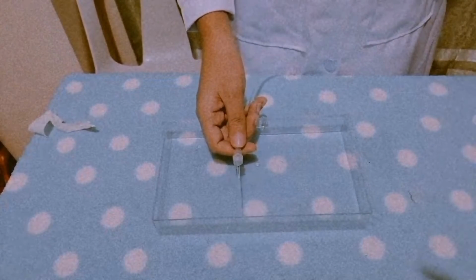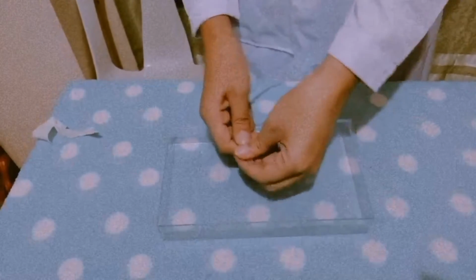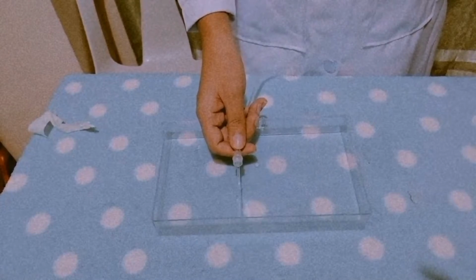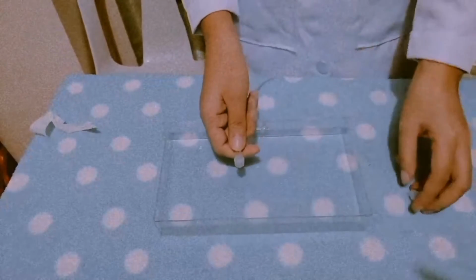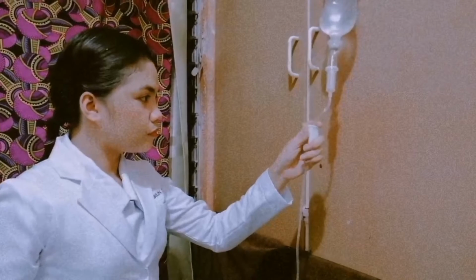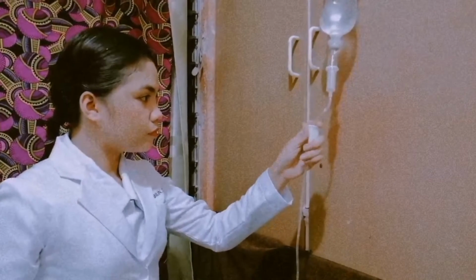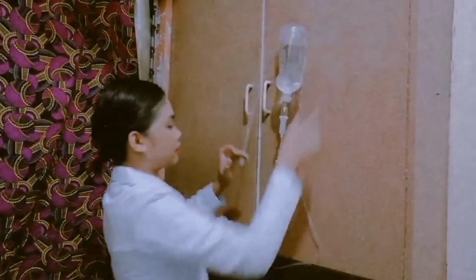Release the clamp and allow the fluid to move through the tubing. The term for this is priming the tubing. Allow fluid to flow until all air bubbles have disappeared. Close the clamp and recap the end of the tubing, maintaining sterility at the setup. This removes air from the tubing which can in larger amounts act as an air embolus.